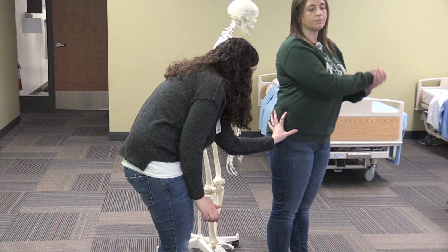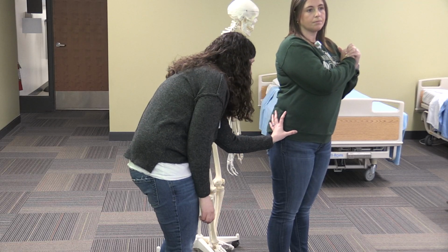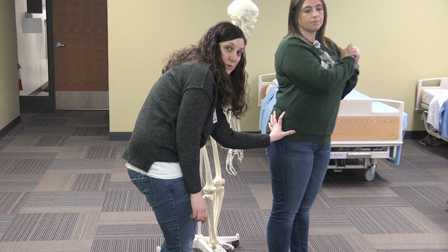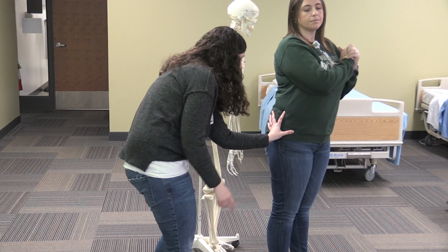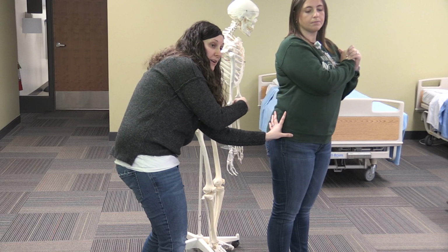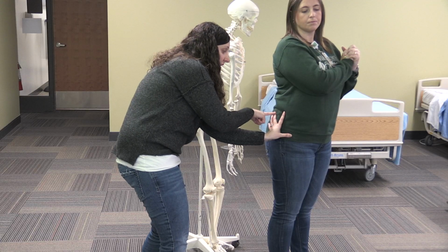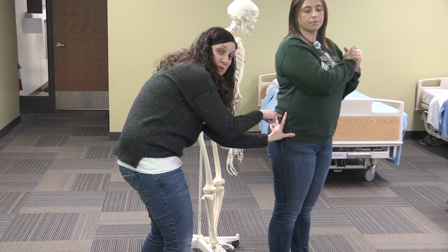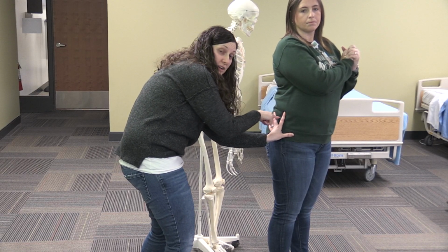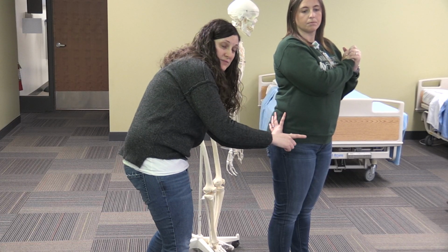Then your index finger, you want to be reaching straight up, so straight vertically, towards the anterior superior iliac spine. Your middle finger, you're going to be reaching dorsally, so backwards, towards the posterior superior iliac crest, and you want to inject between your index finger and your middle finger. And your thumb is pointing towards the umbilicus for that one.